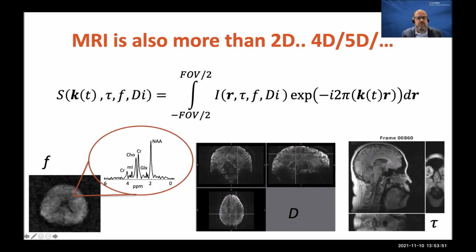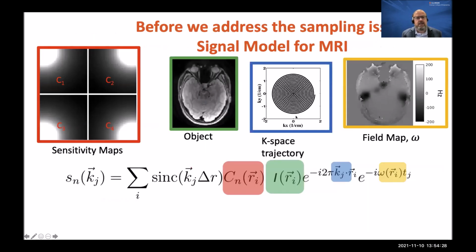And also, for every chunk of brain tissue in each one of those pixels in our image, they have lots of different things in them. And so we have spectroscopy happening with MRI, where we might want to decompose the signals from different molecules in the brain. And those molecules all have protons that have very different local environments, and they give us slightly different frequencies out. And we can encode in that dimension, and we can try to separate out different metabolites in the brain, like NAA, which is an indicator of brain health. So we have a very multi-dimensional data set, and we have to sample all these dimensions. And like I said, if we have to sample with the snapshot imaging approach, it's not going to work.